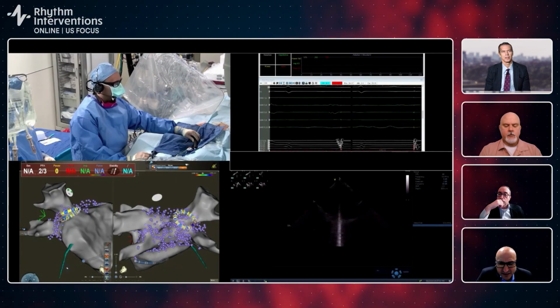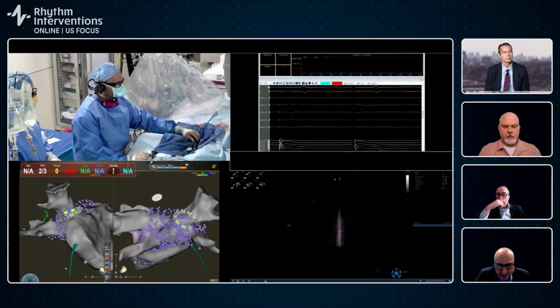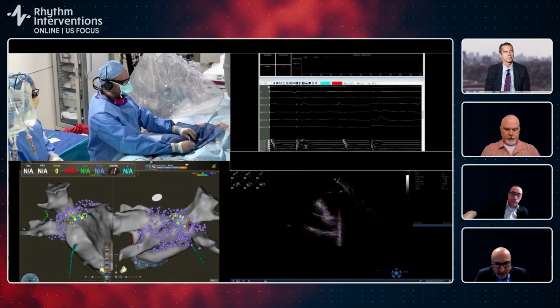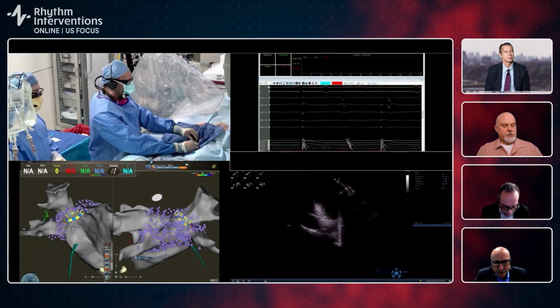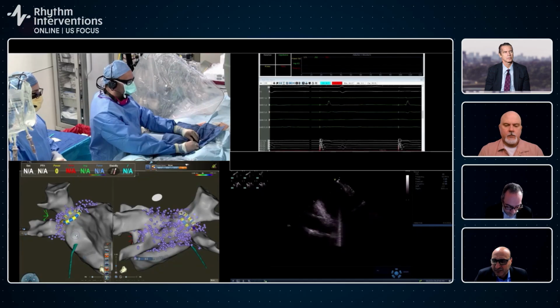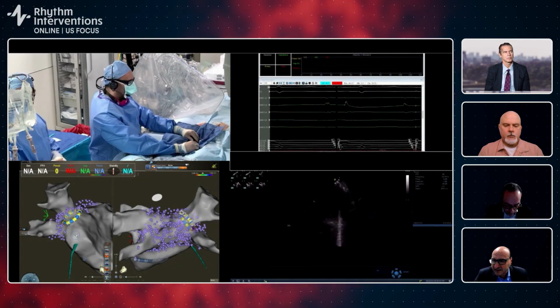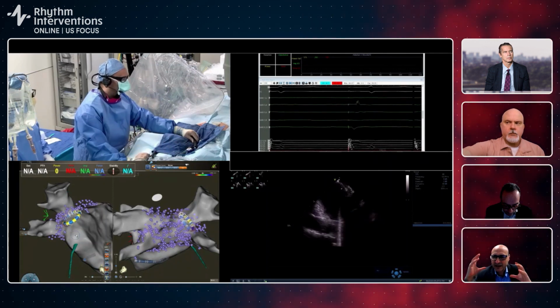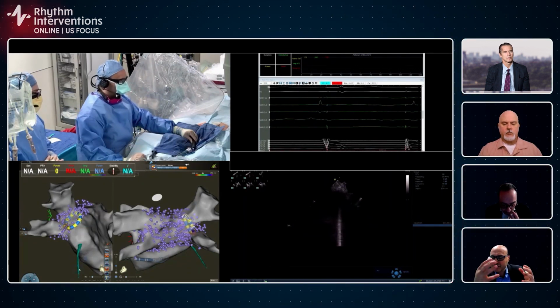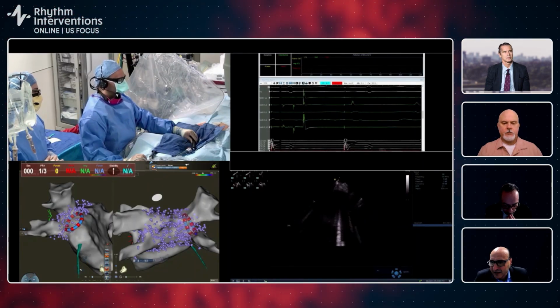So as you see here, this is... Tell me a little bit more about the catheter. So one thing before we do that. Sorry, that's a lag. Go ahead. So this is an area where I usually focus a lot of attention. This is the antral part of the right veins, mostly the right superior pulmonary vein. More than the other veins, the right superior pulmonary vein usually has a very big funnel-shaped ostium, antrum, that goes all the way, significantly back on the septum.